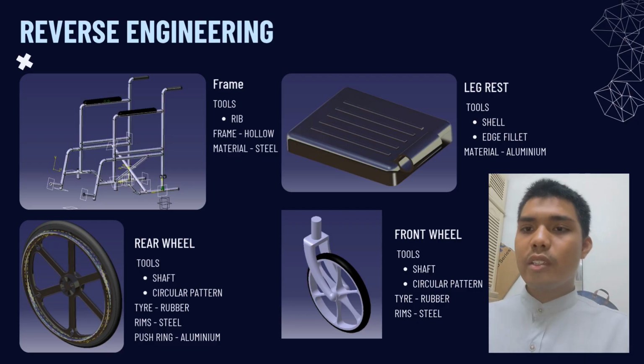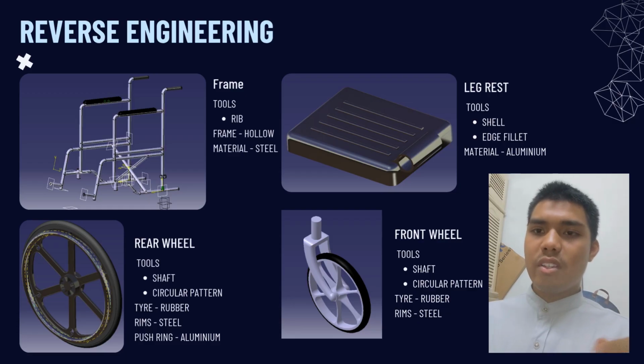Second one is the rear wheels. The rear wheels we can measure using a measuring tape because they are so big. The tire is made of rubber, the rims are made of steel, but for the push ring we use aluminium. So we can measure by sometimes using a caliper and sometimes using the measuring tape.